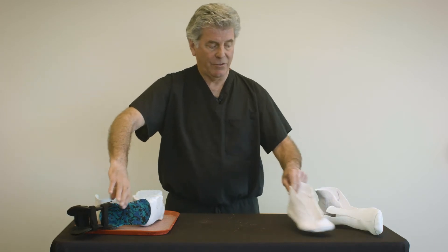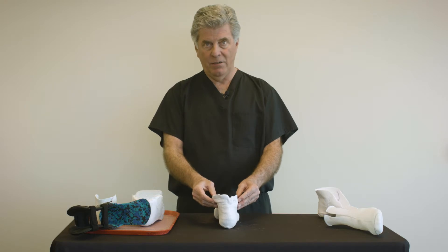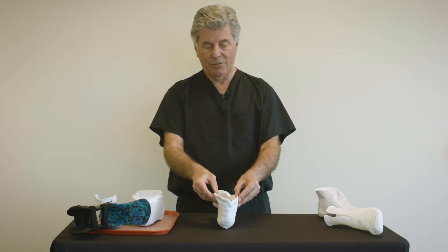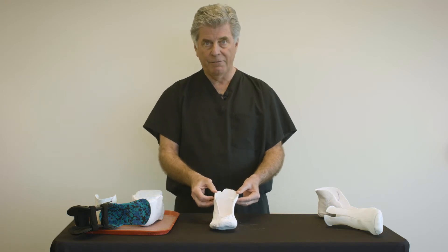The plaster casting has the risk of either over-expanding or being too narrow, particularly like this cast where the practitioner took the plaster cast off the foot too soon.